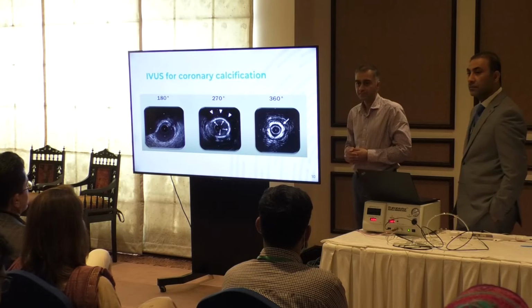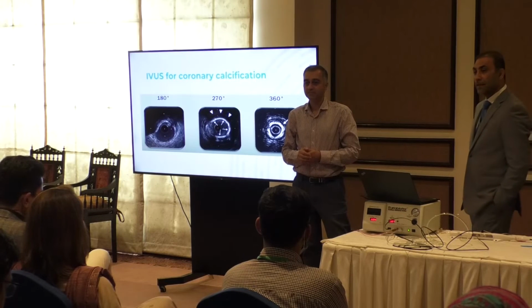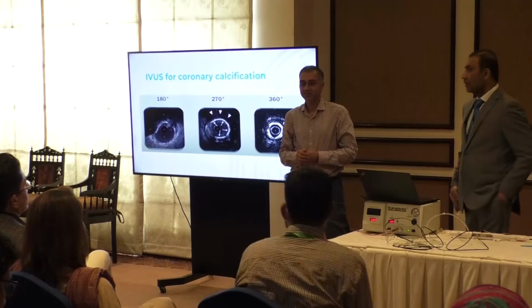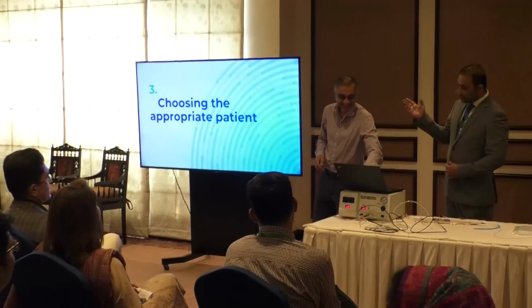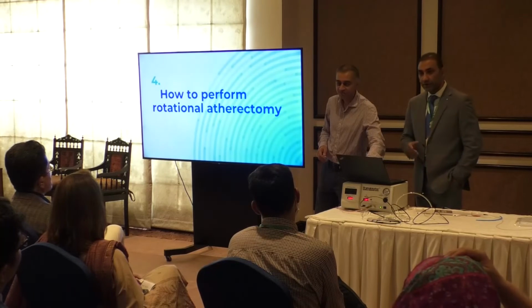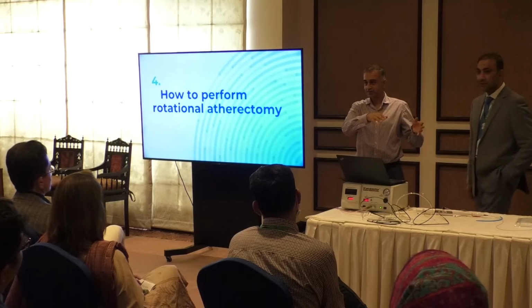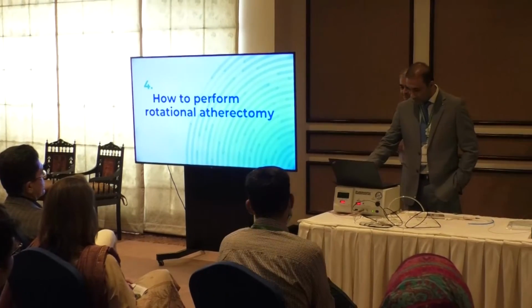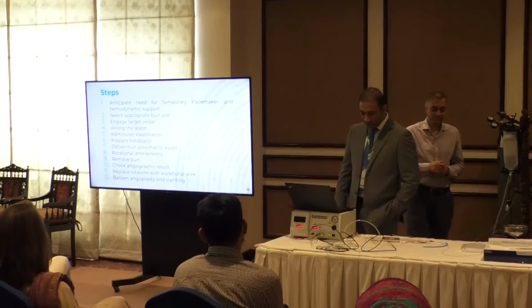So I would like to say that these are theoretical things, and if you proceed more to the practical steps of the rotablation, that will be much better. Yes. No, let us get on with it. These theoretical things can be covered from the books. You must have seen all these slides in the previous session, so we can skip a few of them. If there's anything practical we can discuss that. But don't worry, you'll all get hands-on. We will come to this. No problem. You have been through all these in the previous session definitely.